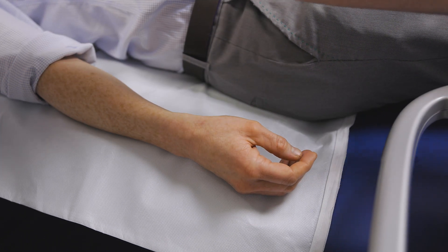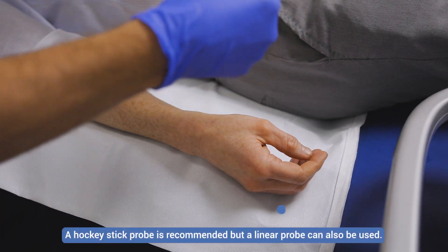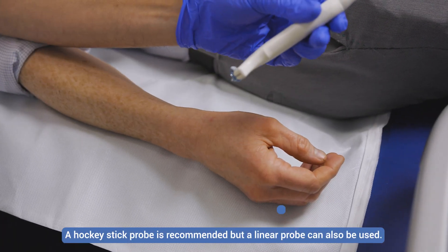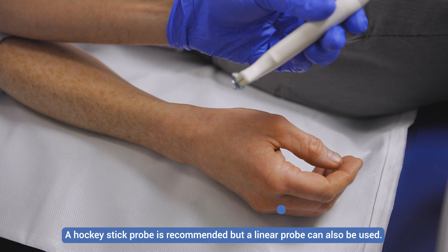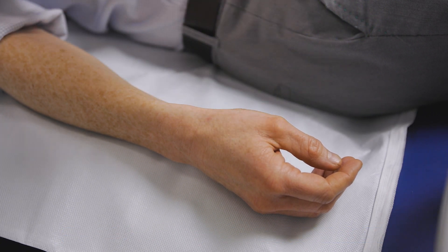The first thing we need to do is orientate ourselves to the ultrasound anatomy. I've got a hockey stick probe here — this is the L6-24 on the E10 GE machine — and it really does give a lovely picture.